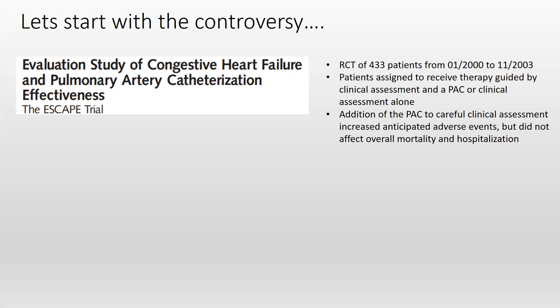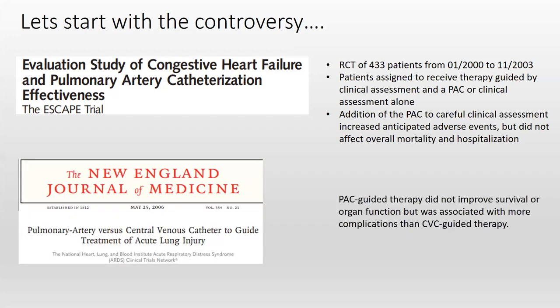The ESCAPE trial was a randomized controlled trial of 433 patients from 2000 to 2003. Patients were assigned to receive therapy guided by clinical assessment and pulmonary artery catheter or clinical assessment alone. The addition of the pulmonary artery catheter to careful clinical assessment increased anticipated adverse events, but did not affect overall mortality and hospitalization. This study, published in 2006, showed that pulmonary artery catheter guided therapy did not improve survival or organ function, but was associated with more complications than central venous access guided therapy.